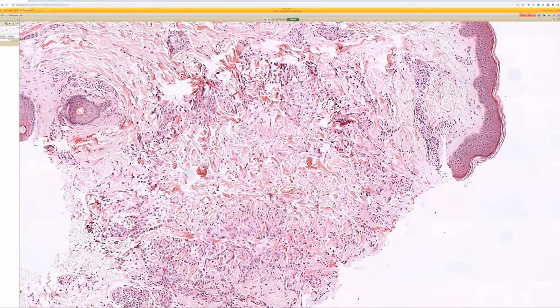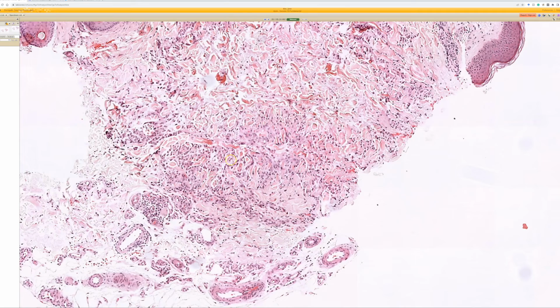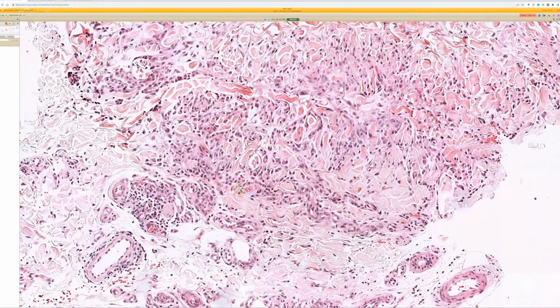Not all cases make a ring, but I really find it quite satisfying that it's both annular, ring-shaped clinically and microscopically in many cases. Now, not always. Some cases microscopically, particularly if you don't get a nice cut through the middle, just show histiocytes that trickle between the collagen here, okay? So I'd like to point that out.